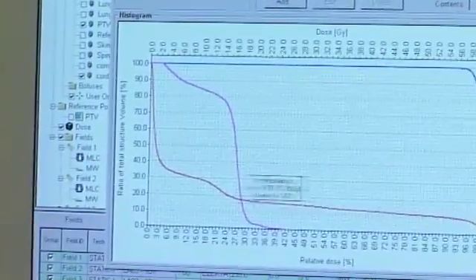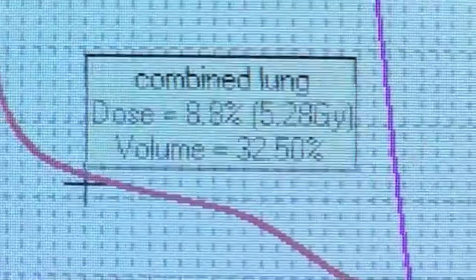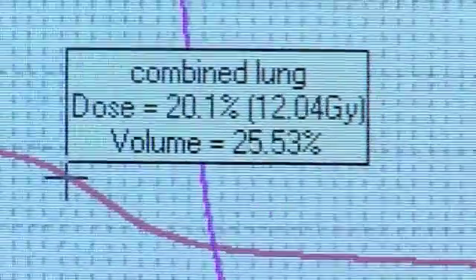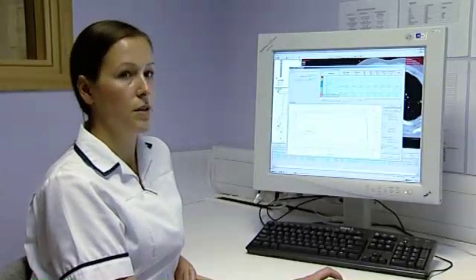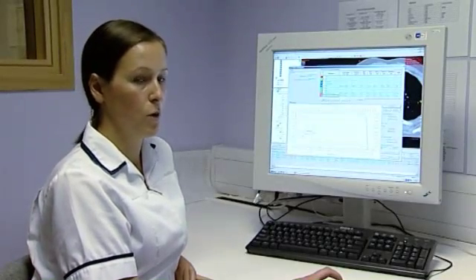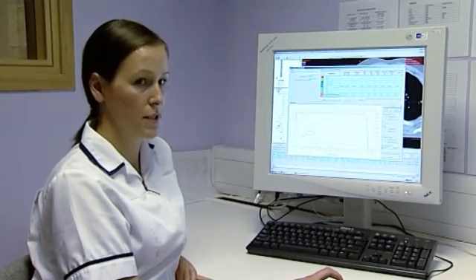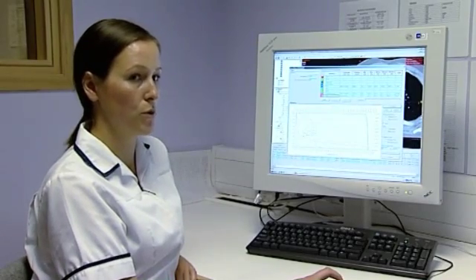From the lines here, this pale pink line we can see represents the combined lung dose. Generally, research shows that nowadays they like no more than 35% of a lung to receive more than 20 grey.